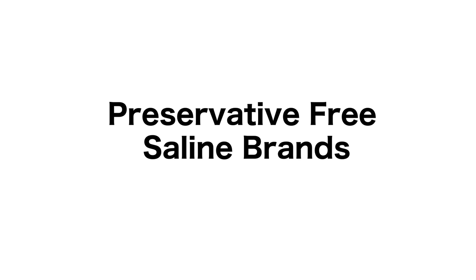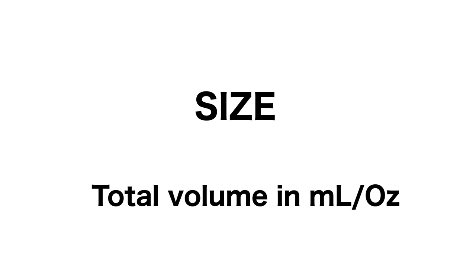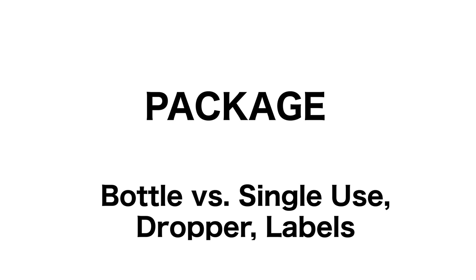Today we're going to be reviewing four brands of preservative-free salines. We're going to look at them in terms of type — which ones are buffered, which ones are unbuffered. We're going to look at the sizes, as in total volume, and we're going to look at the package features: which are bottles, which are single-use vials, what the dropper's like, how they're labeled, and so on.